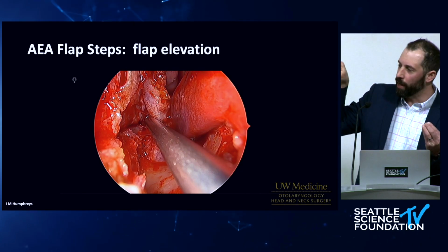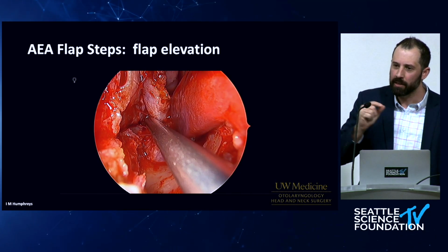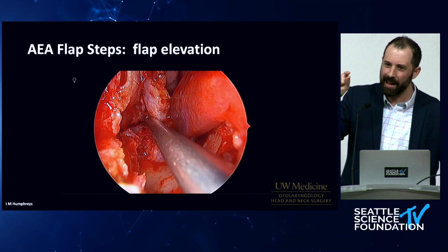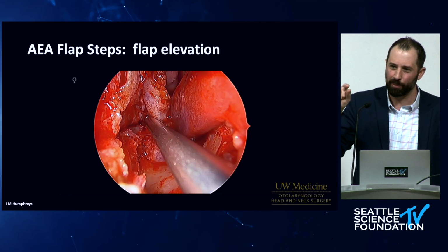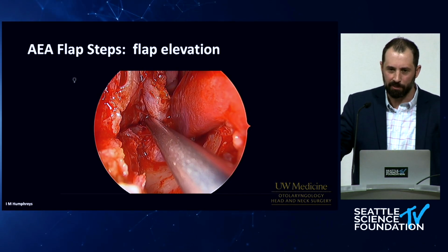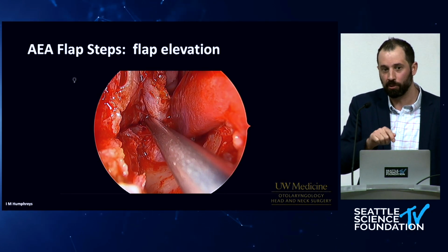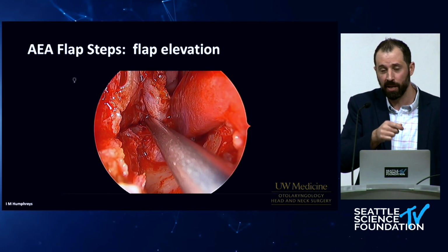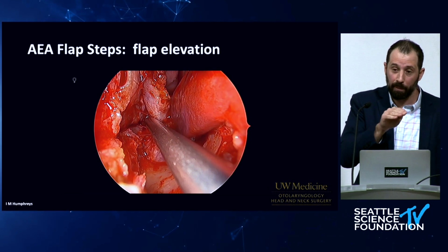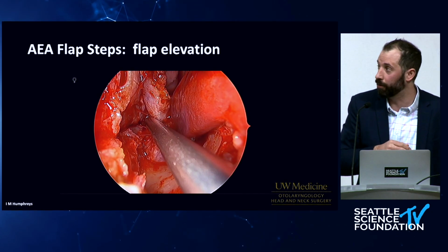And I've had times where I've elevated this out and had created a small tear in that area. And the tear is right in that area where I ultimately want to land for the septal perforation repair. So it's definitely a step if you find that your patient-specific anatomy is such that there is this recess towards the incisive canal. Take your time, go slowly, use instruments like ball tip probes. If you do need to separate it, consider sharp dissection once you have it mostly mobilized out of the canal itself.